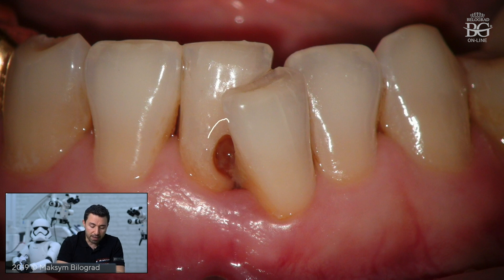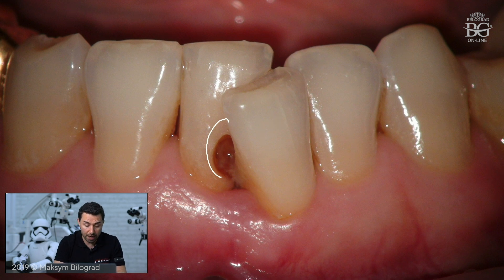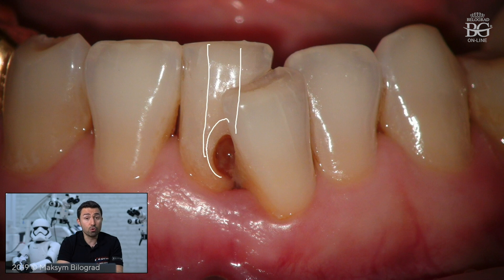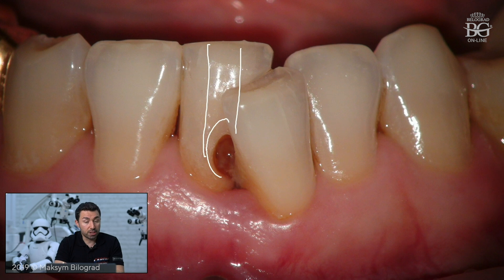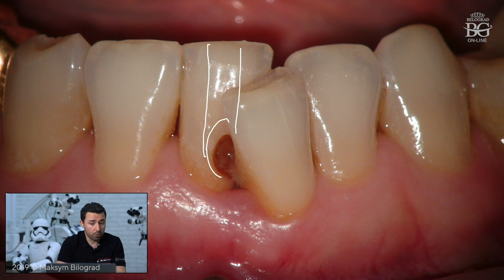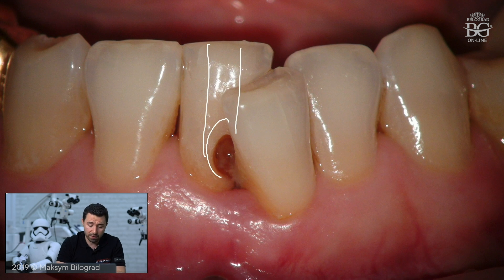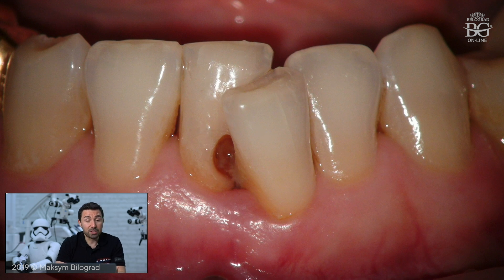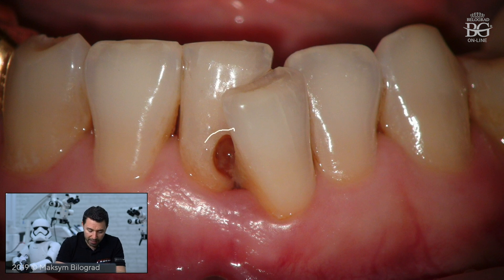Considering the caries defect and the classic endodontic rule of a straight-line axis, after treatment I was not sure we would have enough tooth structure to resist occlusal forces. We discussed the case and I gave alternative options such as extraction with orthodontic treatment, or a crown. We ended up choosing super minimally invasive dentistry with what is called a defect-oriented access.